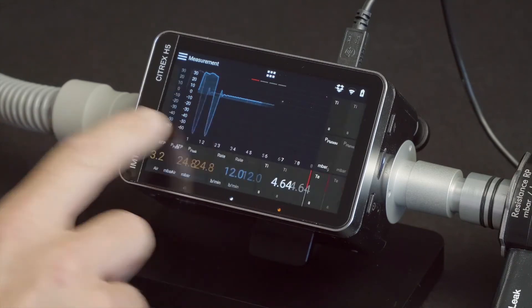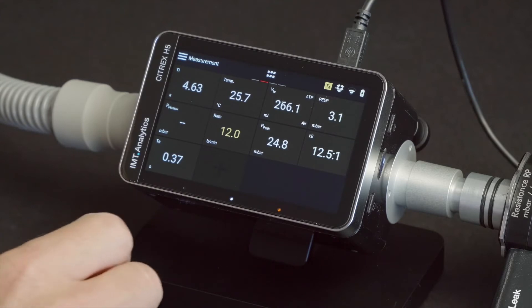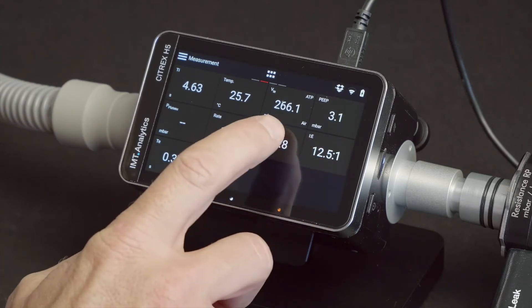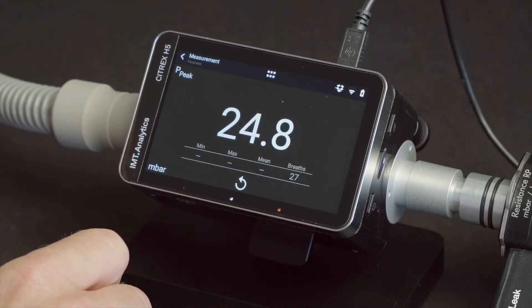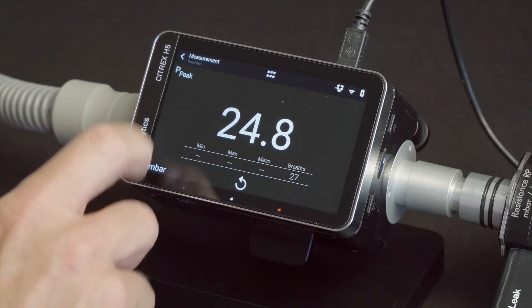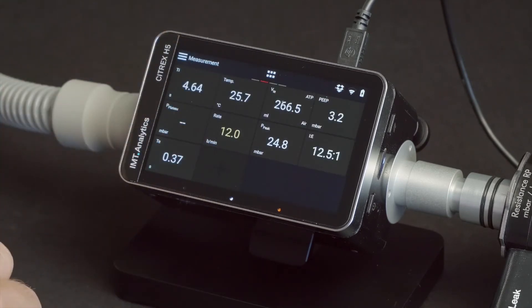Swipe to the next screen, the numerical readings, to access a full screen of the desired parameter. Tap a measurement once. To exit the full screen, press the back button at the top left.